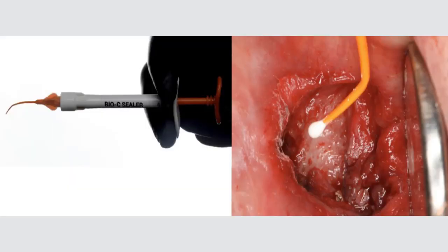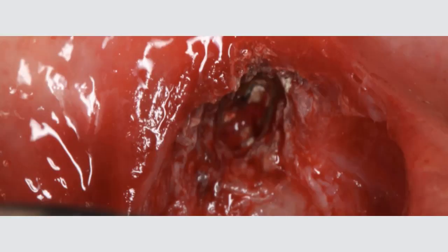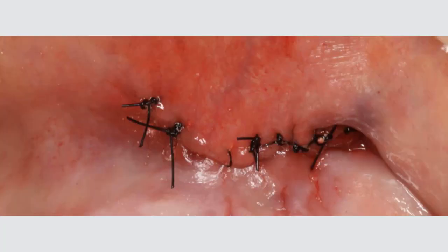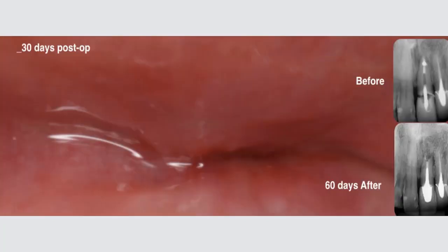See, here is the open wound. Then you go for sealing. This is an endo sealing. As you can see, you can really reach right to the apex based on the drill. Then after you block the apex, you come with the bone, then you graft it, you suture it, and you have your apicoectomy just waiting for the 90-day healing process.